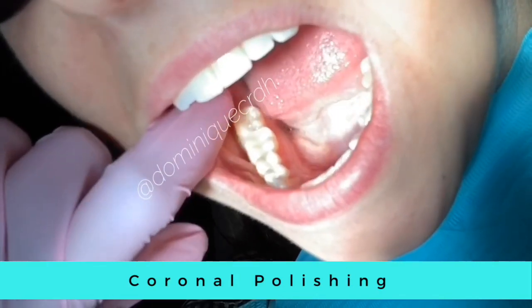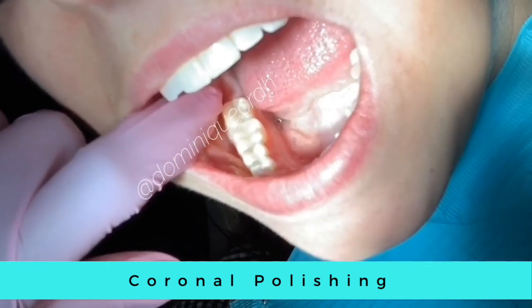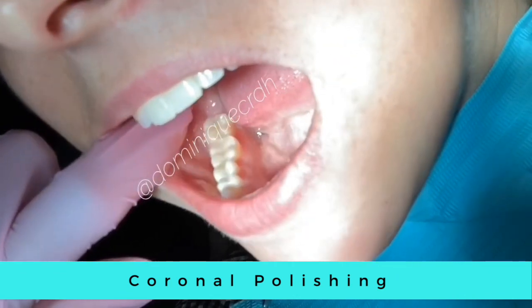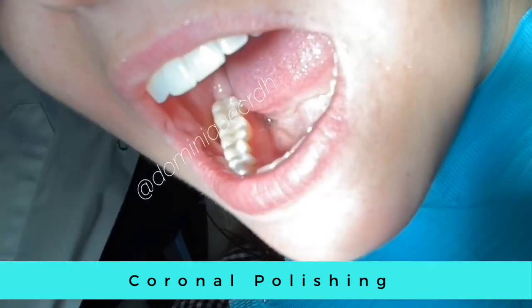One technique I like to use is using my fingers to retract the cheek. You can use this technique without suction — have the patient bite down just a little and retract the cheek so that you can reach those back molars.